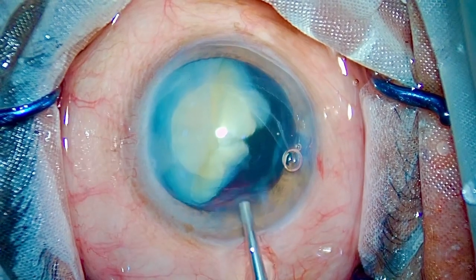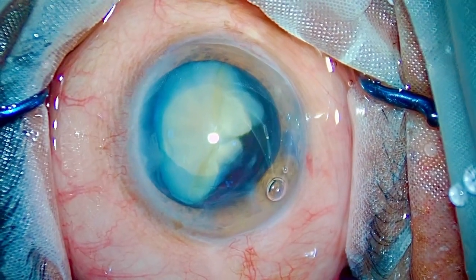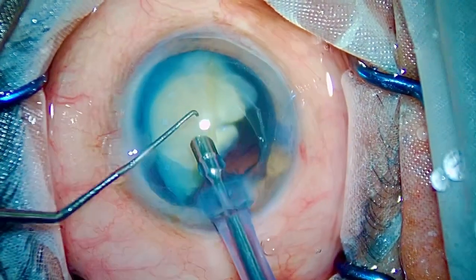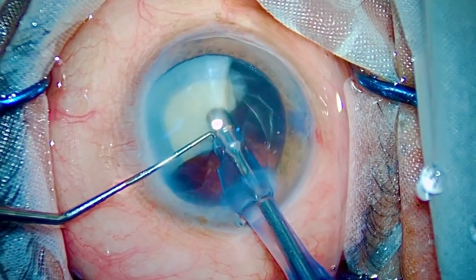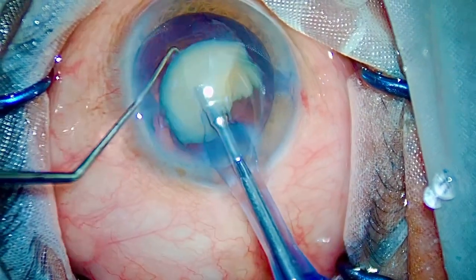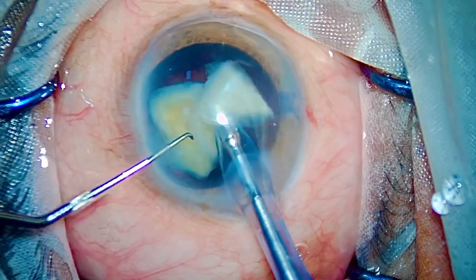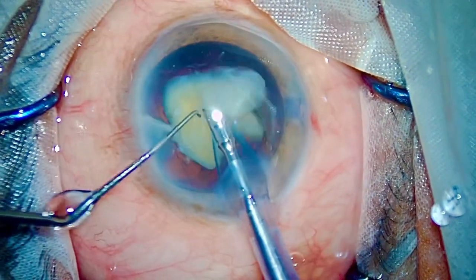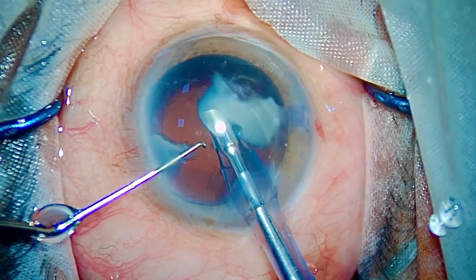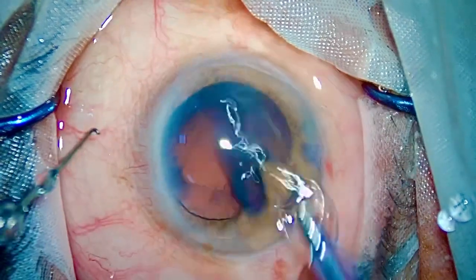Post-occlusion break surge — when the occlusion ends, the posterior capsule tends to come up into the FACO. If you are holding a sharp chopper in your left hand, it can come up to the chopper and the PC can go, just like that. So I have filled the anterior chamber with fresh Visco to protect the endothelium, and I have asked for a dialer for these last pieces. Gives me confidence and keeps the patient safe. At the end of the day, consider every patient as your own parent — safety is the number one priority.